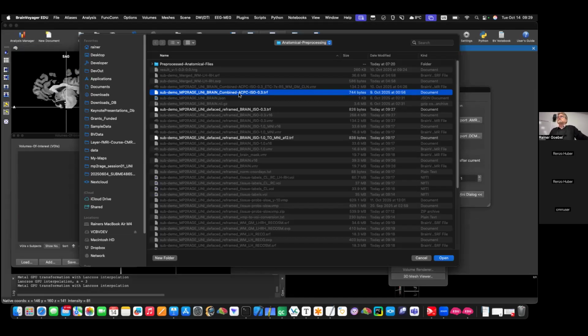You have this file? How did I get the load transformation? So you need, yes, load TRF, load transformation in the 3D volume tools, co-registration, I think, or spatial transformation. Exactly, there should be a lengthy... Then load this combined... You don't have it. Maybe you have to look in the downloads. Let me have a look. This was the downloads. This is the one, combined. Okay, it's the one. Perfect.